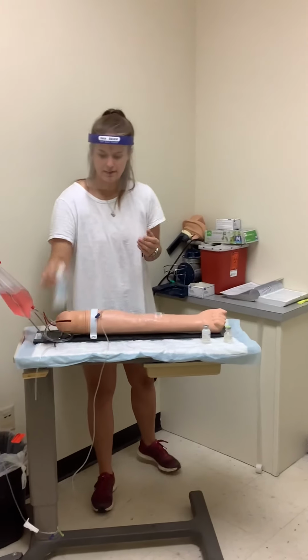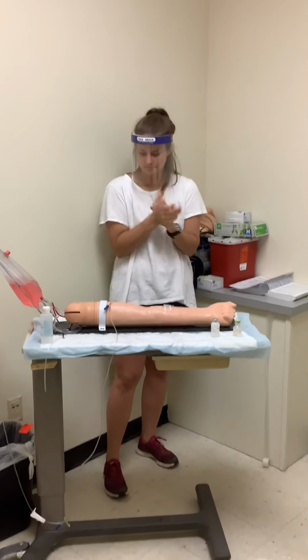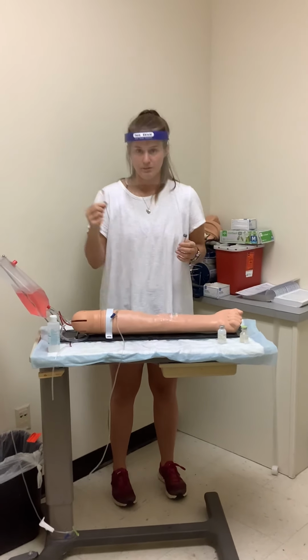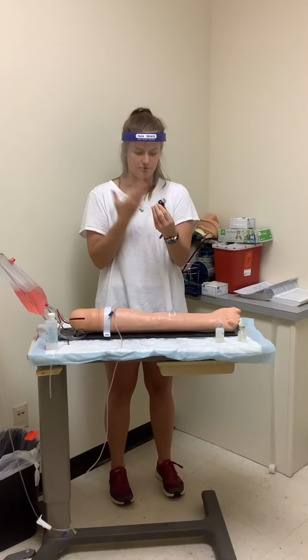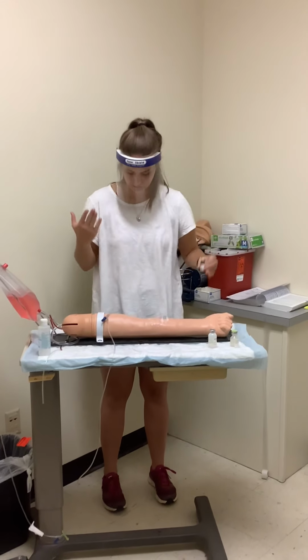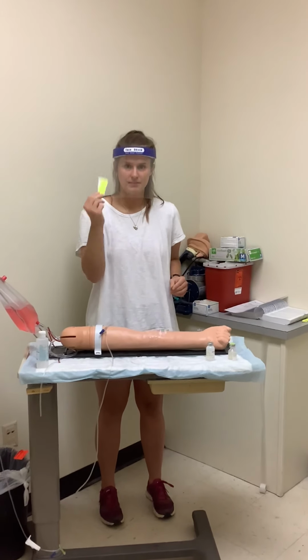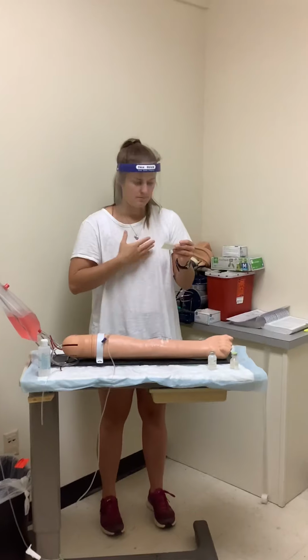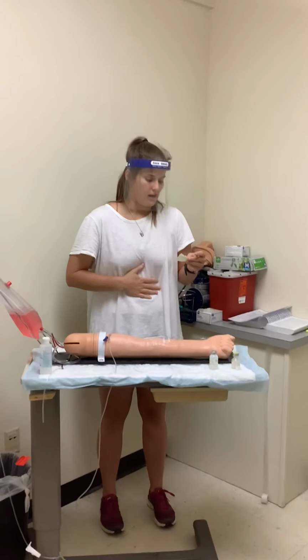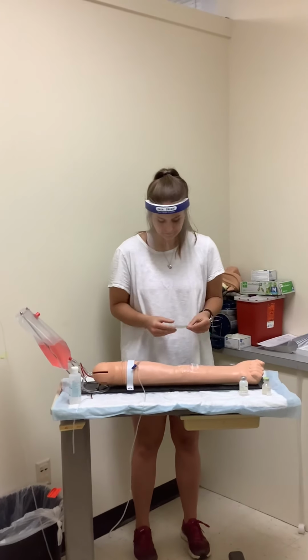So I'm going to perform hand hygiene. Alright, and I'm going to get my syringe, my blunt needle, my medication, which I am checking for the expiration date and checking that it is furosemide, and checking that it is the correct dose. I've got an alcohol pad to scrub my hub, and I have my tag saying my name, my patient's name, what they're getting, which is furosemide, 40 milligrams, which is 4 milliliters, what day it was prepared, which is today, and the expiration date.